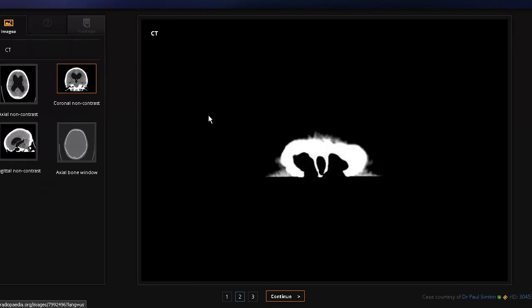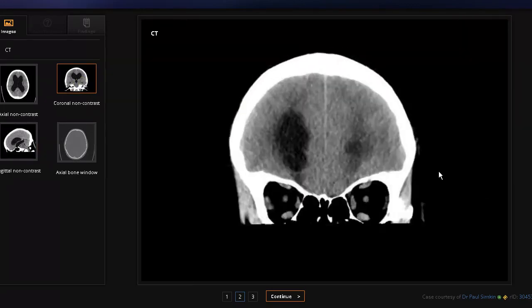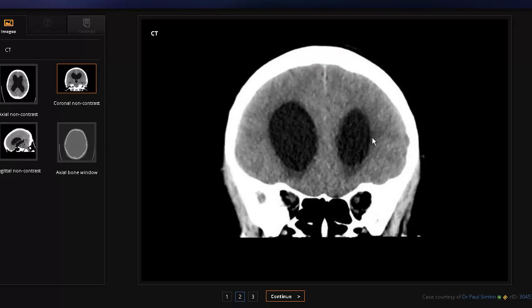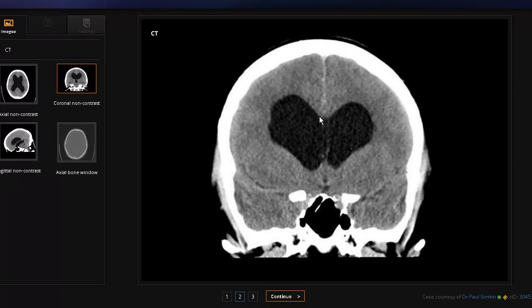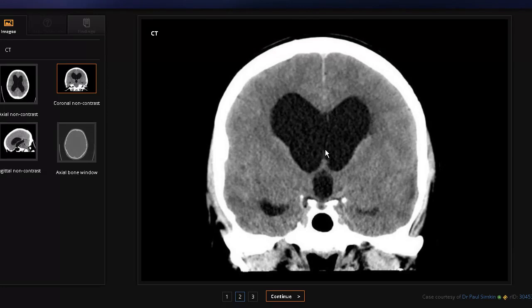Looking at the coronal section, you can see the two bodies of the lateral ventricle, and they're quite dilated — one more than the other. You can see how they meet in the midline. The lateral ventricle has a roof formed by the corpus callosum, and down here we have the caudate nucleus. Here you can see the septum pellucidum in two parts, and between them is the space. Going further back, the third ventricle.